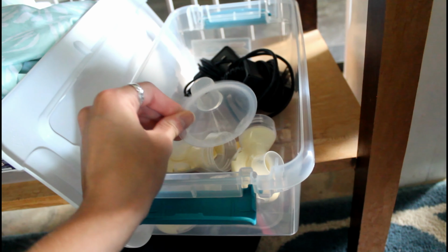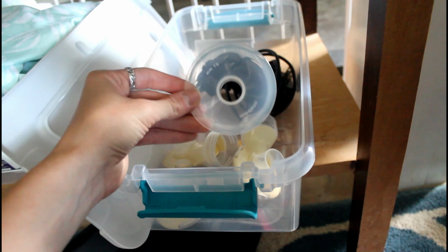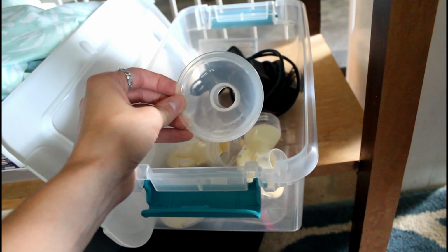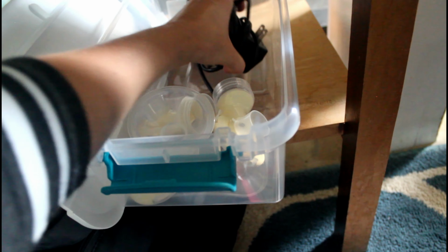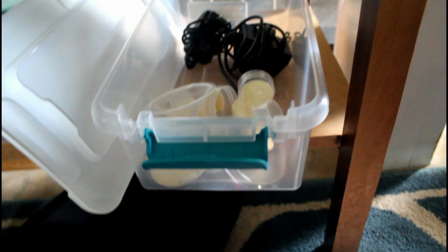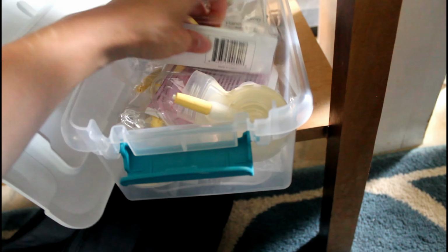When I was first pumping with my first son 5 years ago, oh my god, I did use these, and I feel like this was a good size for me, but now it's not because I've had a couple kids. So these are just more like chargers. This is just kind of stuff that I would grab right away if I needed a charger or something. I do use other chargers that another pump came with, as long as it's the right voltage.